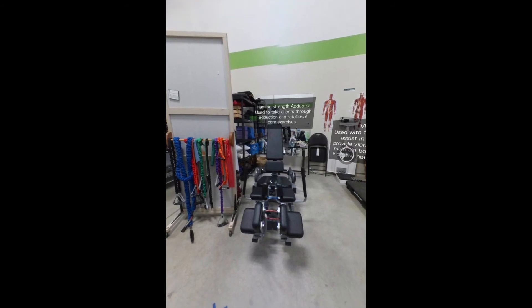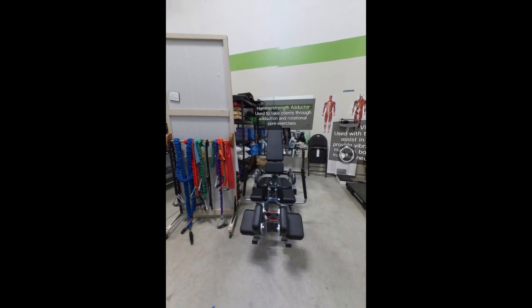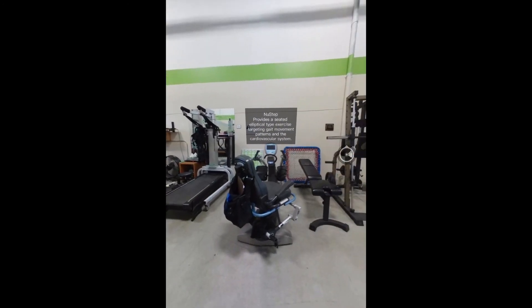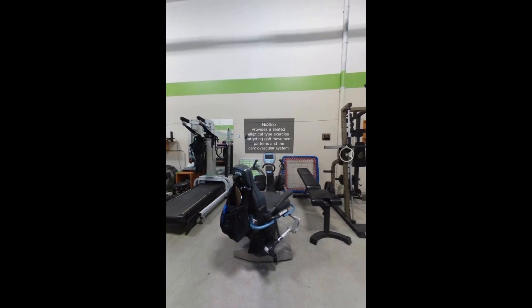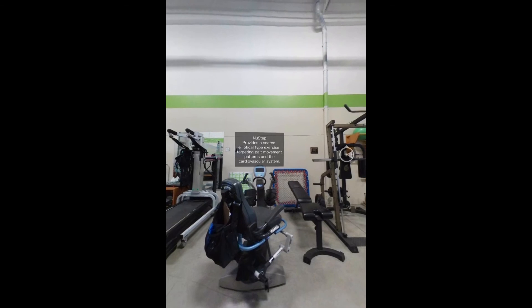The Hammer Strength Adductor Machine is used to take clients through adduction and rotational core exercises. The NuStep provides a seated elliptical type exercise targeting gait movement patterns and the cardiovascular system.